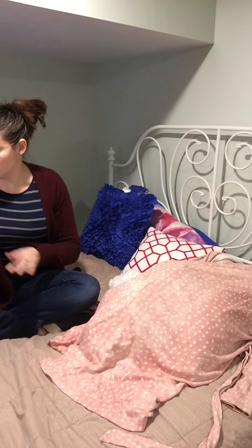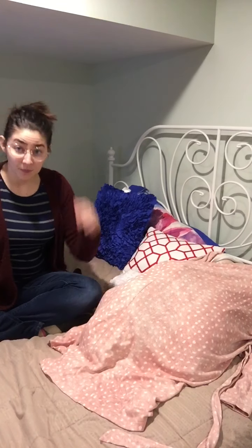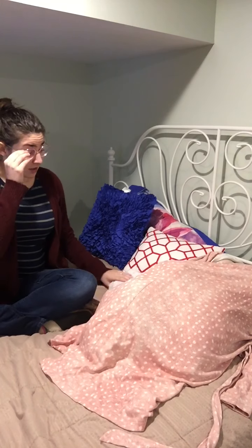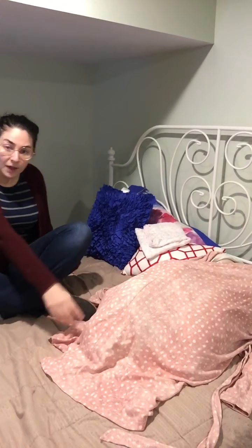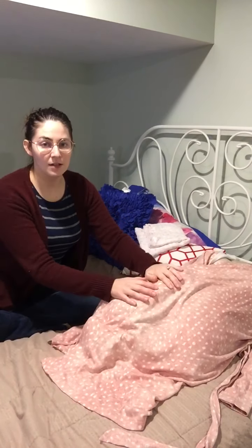This video is a demonstration of performing an intrapartum vaginal exam and fetal heart rate auscultation. Here we have my client, sitting with baby on her belly. One of the first things you do when a mom is admitted into care is do a vaginal exam if she consents.